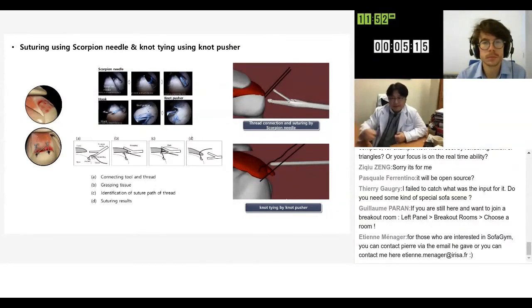And in another scenario, we needed to implement consecutive motion tasks, composed of sub-tasks as shown here in the diagrams. So we needed to make specific code as a plugin for SOFA to implement these sub-tasks to be combined for the whole task procedure simulation.